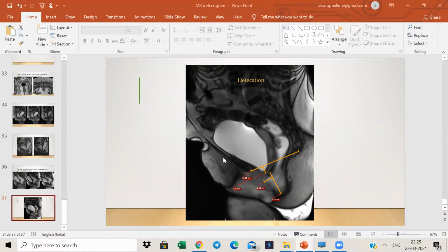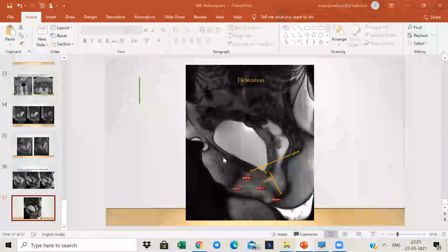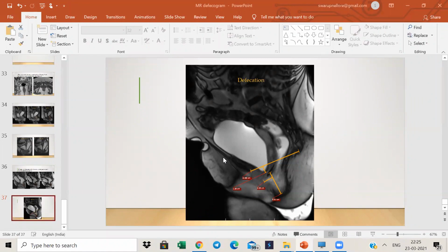Then we would talk about the sphincter mechanism. So we would also talk about the components of the sphincter, like the external or the internal anal sphincter. If at all you find any kind of abnormality in these, you would mention those. So the initial part of the report will be about the structure or the anatomy of the pelvic floor.